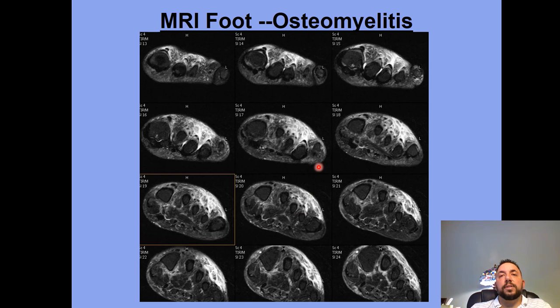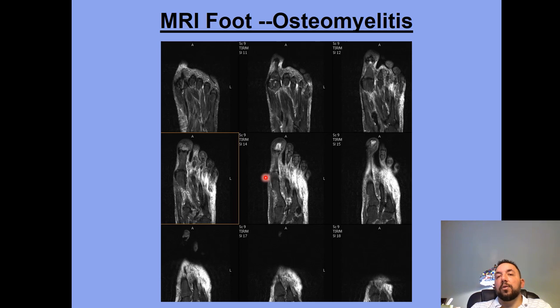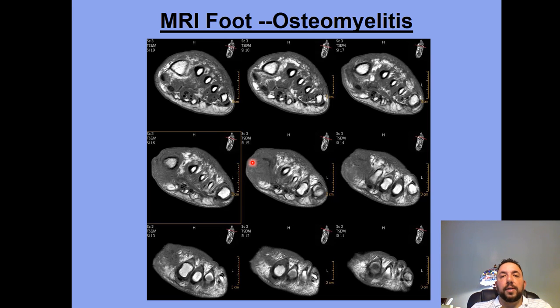So it's important for us to image these patients as quickly as possible, but please keep in mind as safely as possible. When imaging for osteomyelitis, often the patient has a cream on, they're painful to the touch, it's very uncomfortable for them. So please keep in mind that when imaging for osteomyelitis, they can be very uncomfortable when positioning them. Try to scan as fast as possible with as low of a SAR setting as possible so they don't heat or burn. You can see the invasion into the toe there as well, and that's a patient with osteomyelitis.